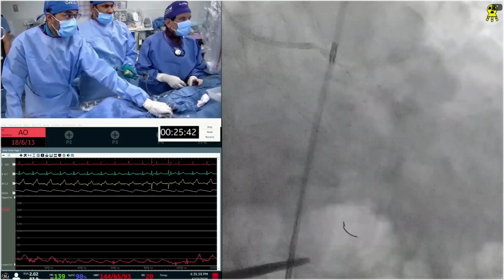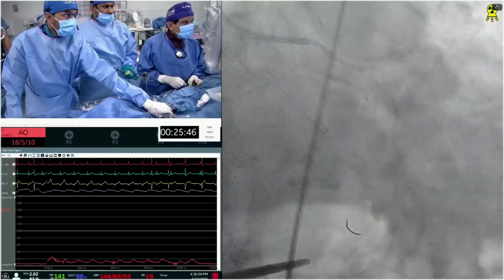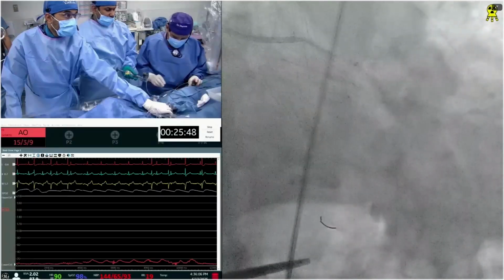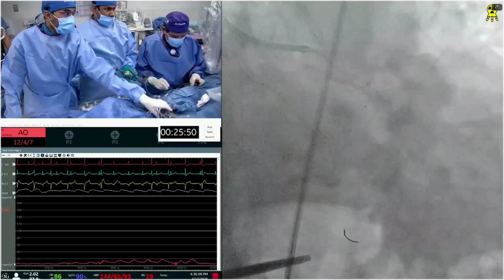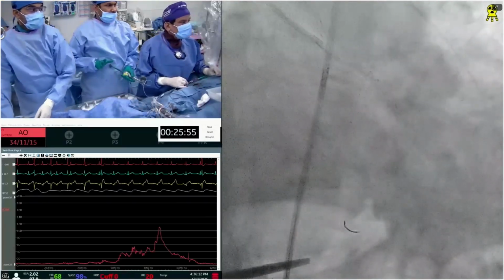Yeah, because I would be concerned if we have to kiss here at the end and you only have that guide extender. There could be some issues. Now the guide extender will go, but the question is, can the guide go? Yeah, that's the question. No guide.